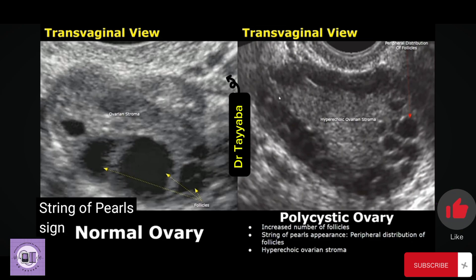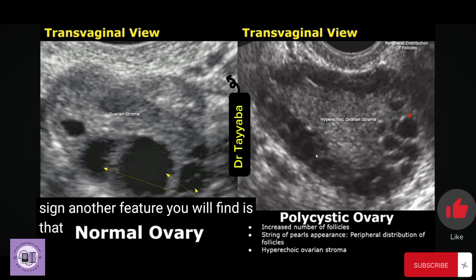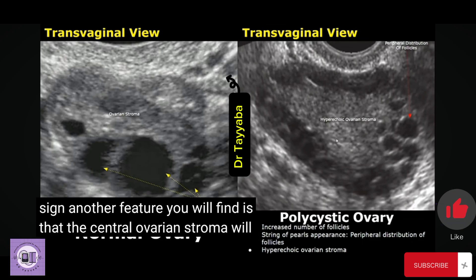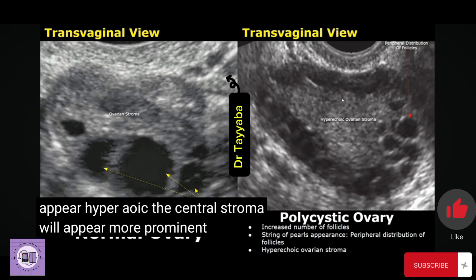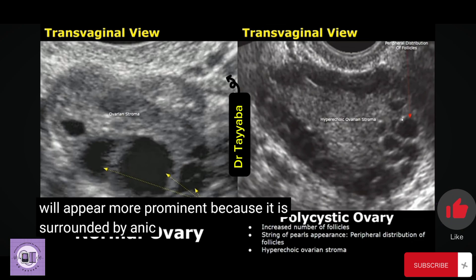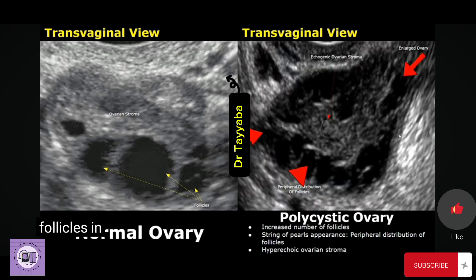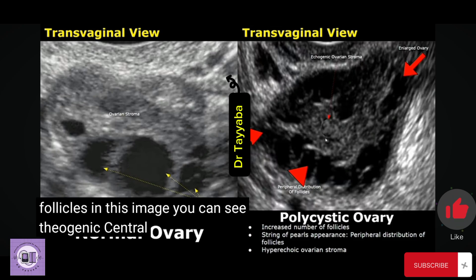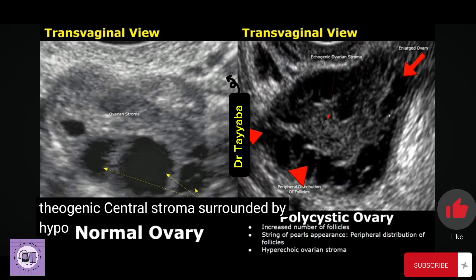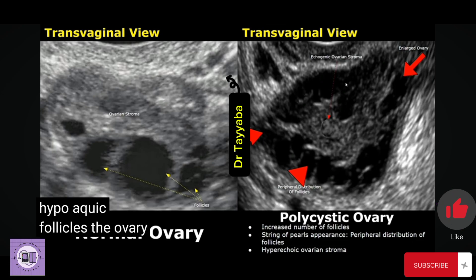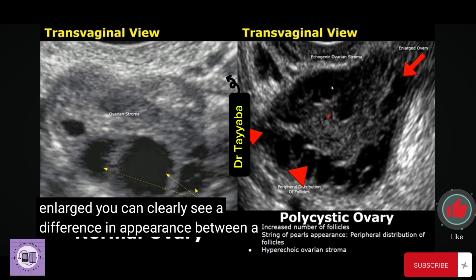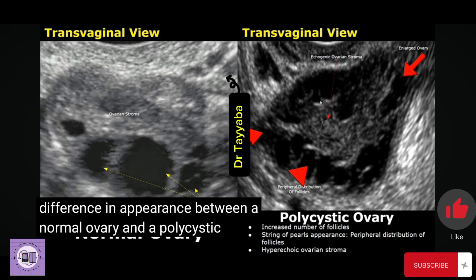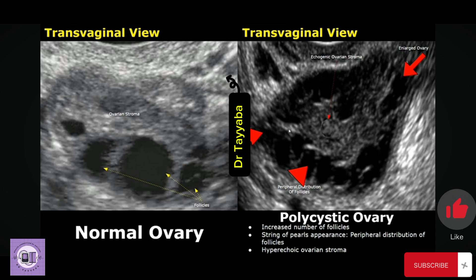This is another image showing the polycystic ovary. You can see various follicles all around the periphery — the string of pearls sign. Another feature is that the central ovarian stroma will appear hyperechoic and more prominent because it is surrounded by anechoic or hypoechoic follicles. The ovary is also enlarged. You can clearly see the difference in appearance between a normal ovary and a polycystic ovary.